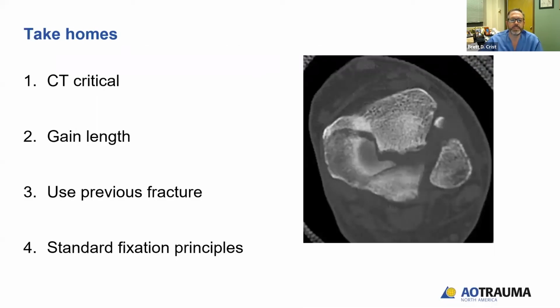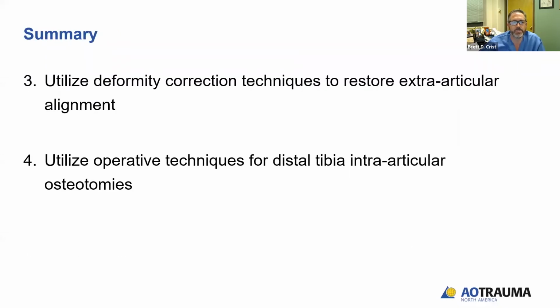So the take-homes for intra-articular osteotomies: CT scans are critical. You want to understand how you can regain length if things are short. For delayed fractures, for the most part, you're going to use the previous fracture planes and then use standard fixation principles.